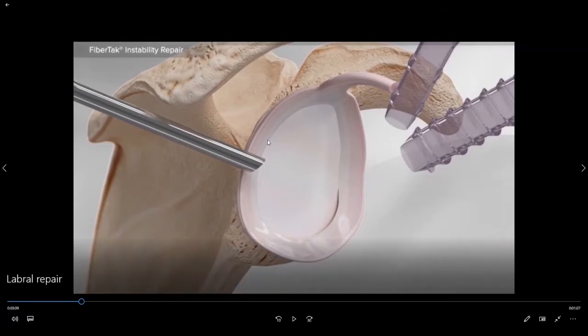So in this particular shoulder, this is the front of the shoulder, this is the back of the shoulder, and we access the shoulder through a series of cannulas or portals that we then bring in a camera so that we can watch the procedure. This camera is being brought in from the back of the shoulder and we are looking at a labral tear extending from the mid aspect of the front of the socket all the way down near the bottom of the socket. And again this means that all of this tissue right here is no longer attached to the bone and it's loose and can be flapping around.